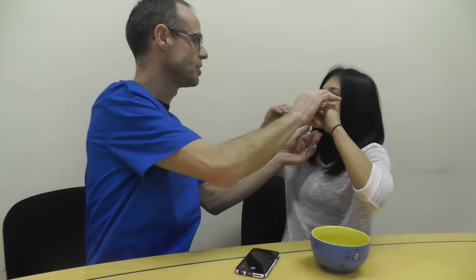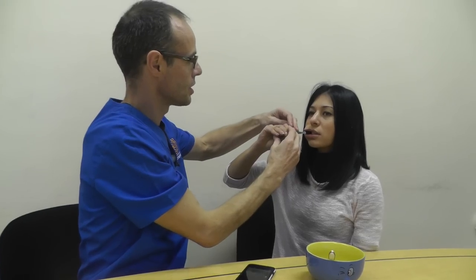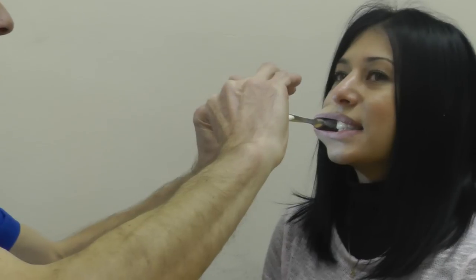Now I want to take the lateral photograph. For the lateral photograph, let's take one of those spoons out and put it on the side there. Now turn your head slightly this way. I'm going to hold the spoon — let go of the spoon. I'll hold the camera up, and then smile. I'll come around to the side, view like this, and okay — we've got that view.